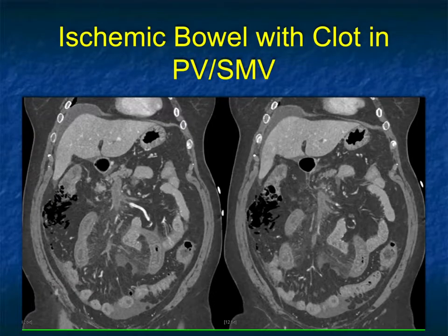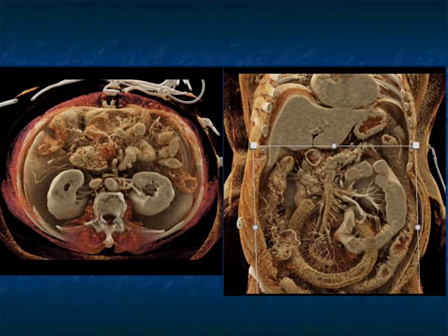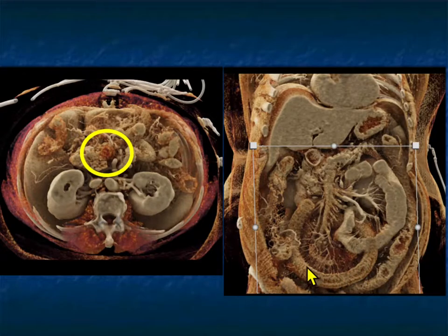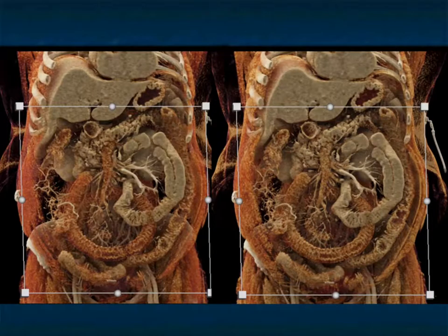Here's a patient with ischemic small bowel with a clot in the portal vein and SMV. You see the thickened small bowel loops, the edema, the haziness in the mesentery, and the extent of involvement. Look how nicely you can see the clot right there on the cinematic rendering — the fold pattern, the edema, the prominent vasorecta, the thrombus, and the abnormalities in the patient's small bowel.